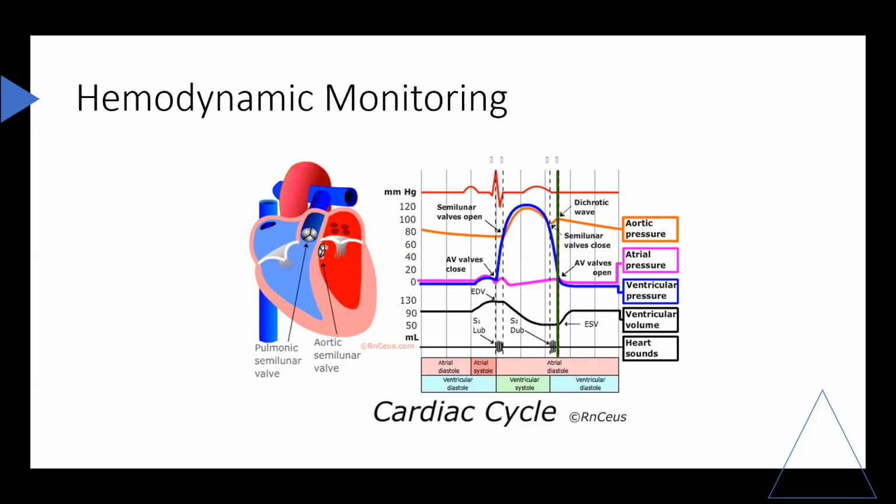Measurements typically include systemic arterial pressure, central venous pressure, pulmonary artery pressure, as well as arterial and mixed venous blood gases and cardiac output. Once obtained, these measurements can be used to calculate a series of derived variables including oxygen delivery, cardiac index, stroke index, vascular resistance, and cardiac work, which in turn can be used to better define abnormalities in the cardiopulmonary function and ultimately guide therapeutic interventions.